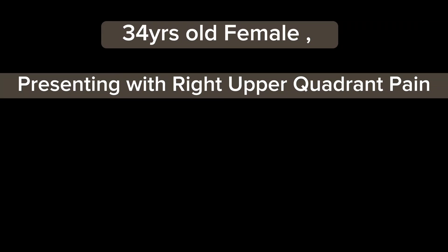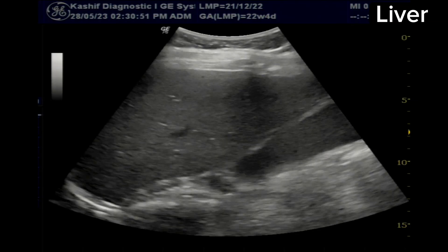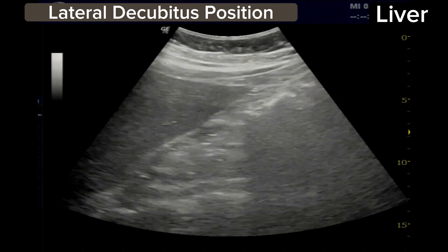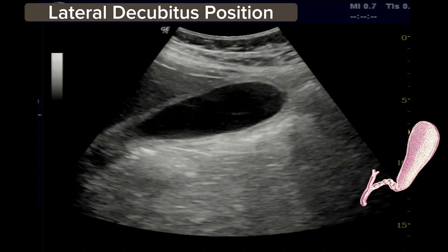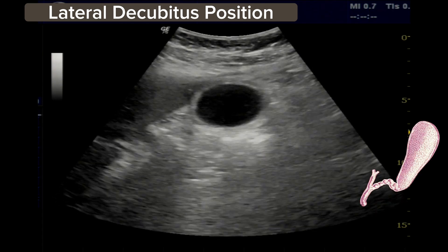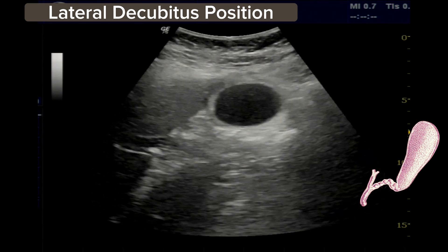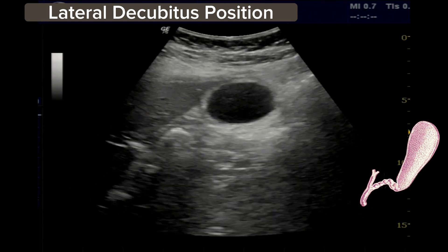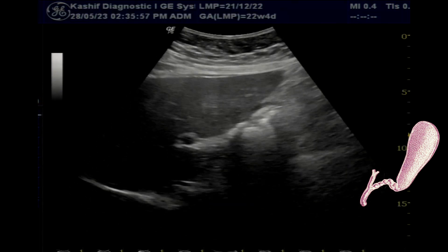This is a 34-year-old female presenting with right upper quadrant pain. The doctor referred the patient to rule out the cause of the pain. The scan is started in lateral decubitus position.